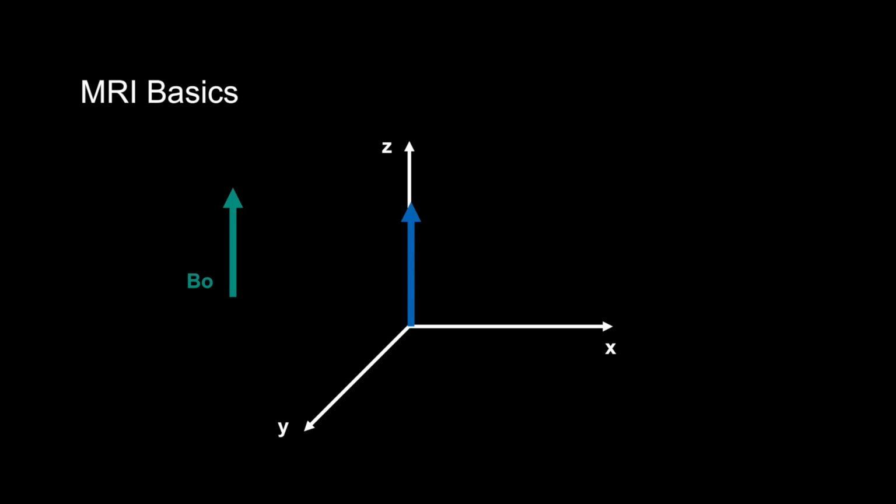Let's look at that in another way. Instead of looking at it in the magnet or on an MRI diagram, we can look at it on this XYZ Cartesian system. So again, the magnetic field here is in the direction of the z-axis, which is down the bore of the magnet. The net magnetic moment is going to be in the direction of the main magnetic field, shown here as a blue arrow. An RF pulse is applied at the right frequency and at a particular flip angle, here 90 degrees for simplicity. And again, it's going to do two things.